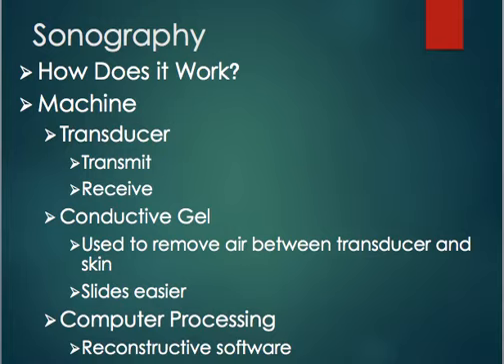Most facilities have a gel warmer with the machine, which helps warm the gel up so it's a little bit more comfortable for the patient when they squeeze it on. If we use cold gel, it's a little startling sometimes. If you've ever had an ultrasound, you know. I've had both cold and warm gel, and I definitely would prefer having warm gel. So for our patients' comfort, if we have the option to warm up the gel, that is the best practice.